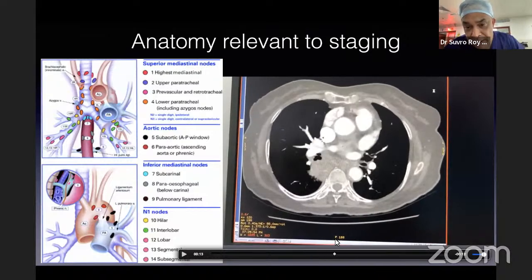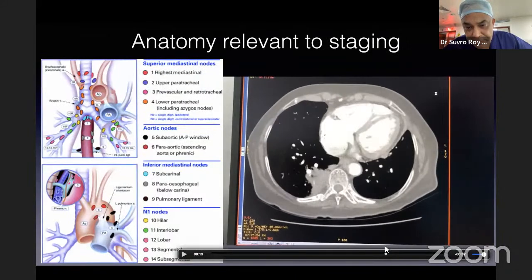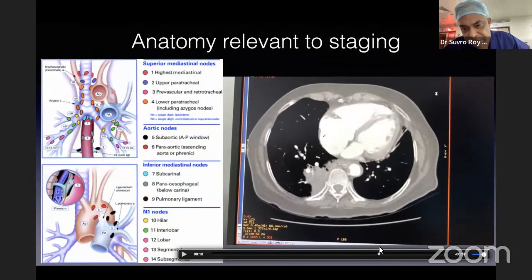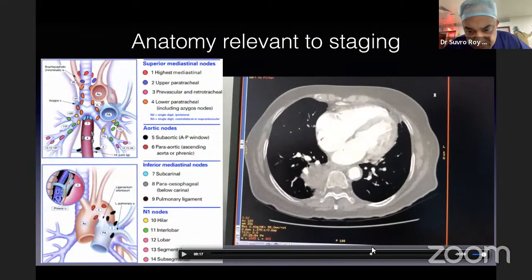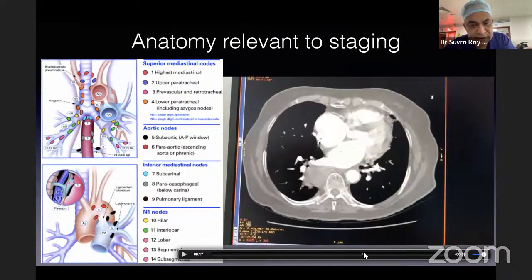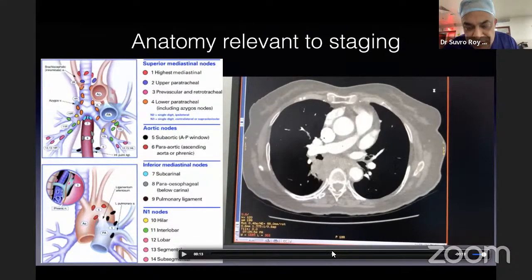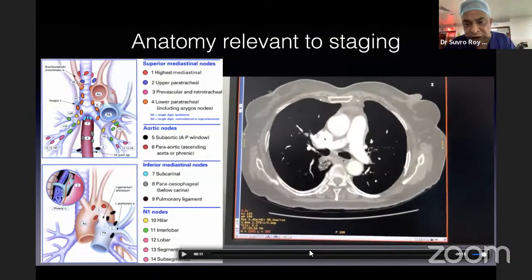Perhaps we'll have a look at the abdominal windows if I have. And then there is an element of obstructive atelectasis. Now, even in the lung windows, can you make the difference? If you change the windows, you will be able to make the difference between potential obstructive atelectasis and the tumor in terms of the density. If you change the windows, you will usually be able to make the difference. We'll show you. This is slightly wider windows. You need to make the windows slightly shallower to see this very well.